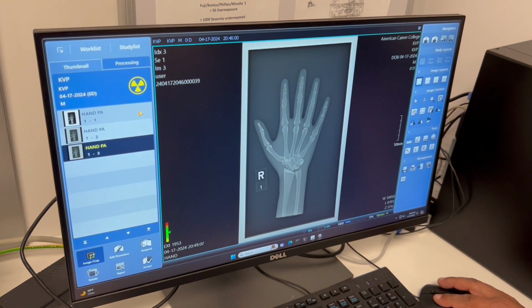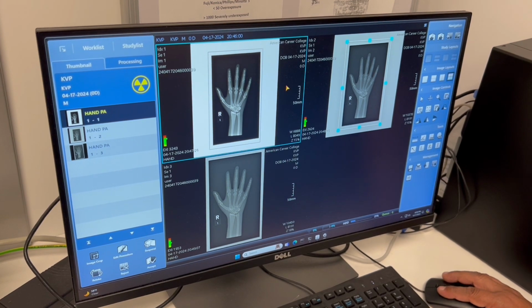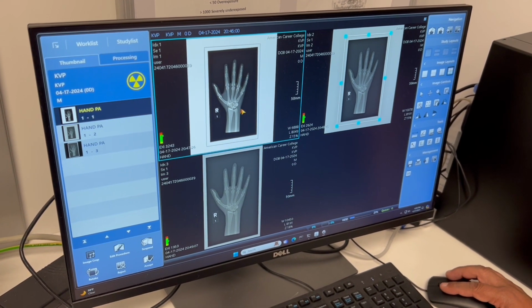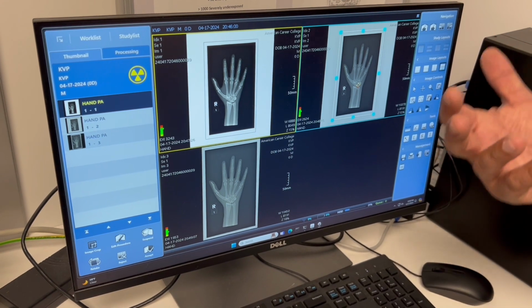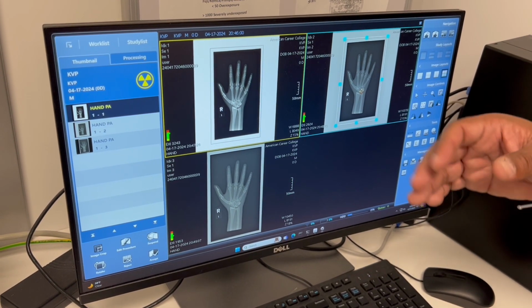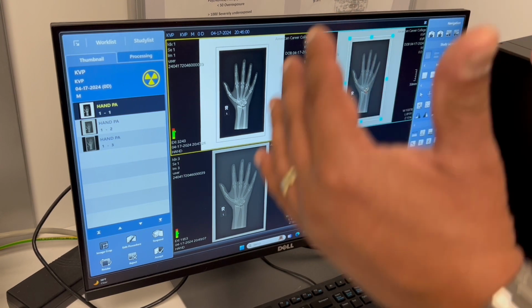So let's do this here. Now that we framed it out, we're gonna put it here. So let's do this, here we go. So look what I did. I opened up the frame so you guys can see how when you increase the kVp, you have more gray scale, right? So the reason why this happens is the more kV, the more X-ray photons go through the object. That means more signal is recorded. More signal means more densities. More densities is going to make the scale longer, right?